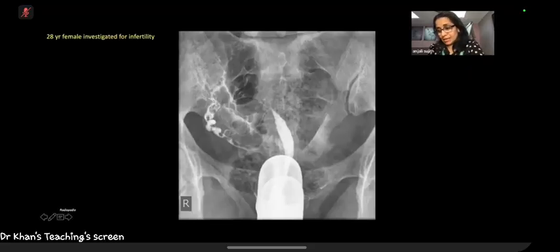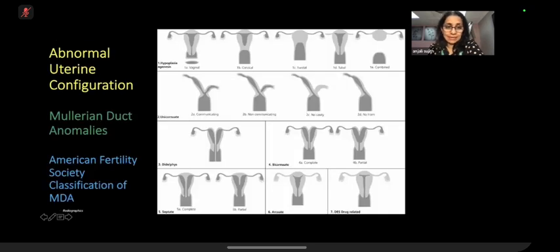Good. Okay, good. So we'll come back to the same slide again. So first, let's have a discussion on this slide. So that takes us to Mullerian duct anomalies.